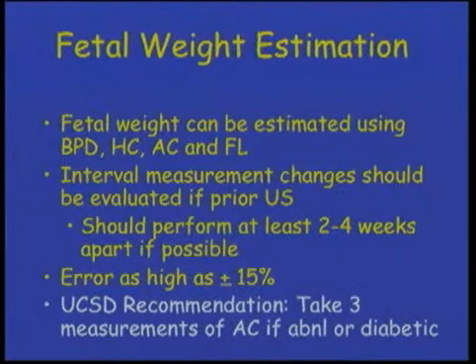At our institution at the University of California, San Diego, we take 3 measurements of the abdomen circumference in the 3rd trimester if it's an abnormal number or if the patient is diabetic.